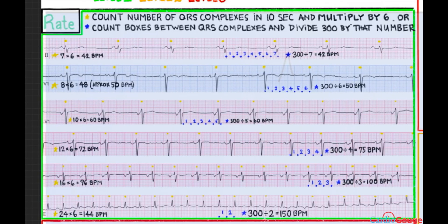Let's start with the rate — the easiest thing. You can calculate the rate by counting the number of QRS complexes in 10 seconds and then multiplying by six. A standard ECG is 10 seconds. Counting here: one, two, three, four, five, six, seven. Seven times six is 42 beats per minute. So you can do the rate that way.